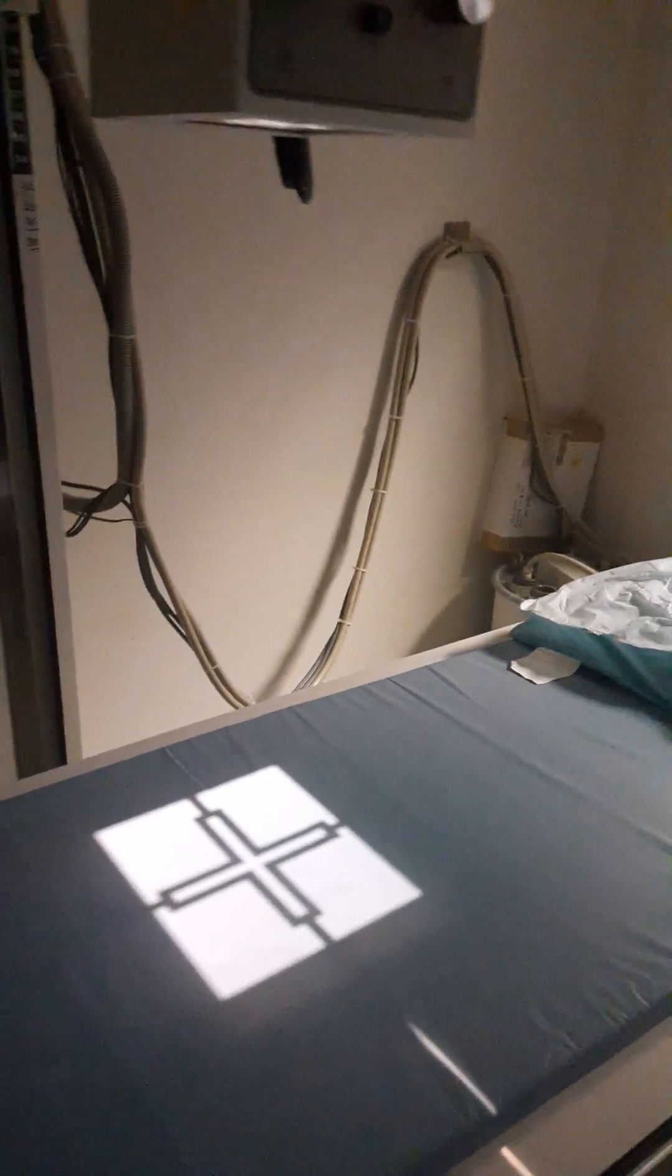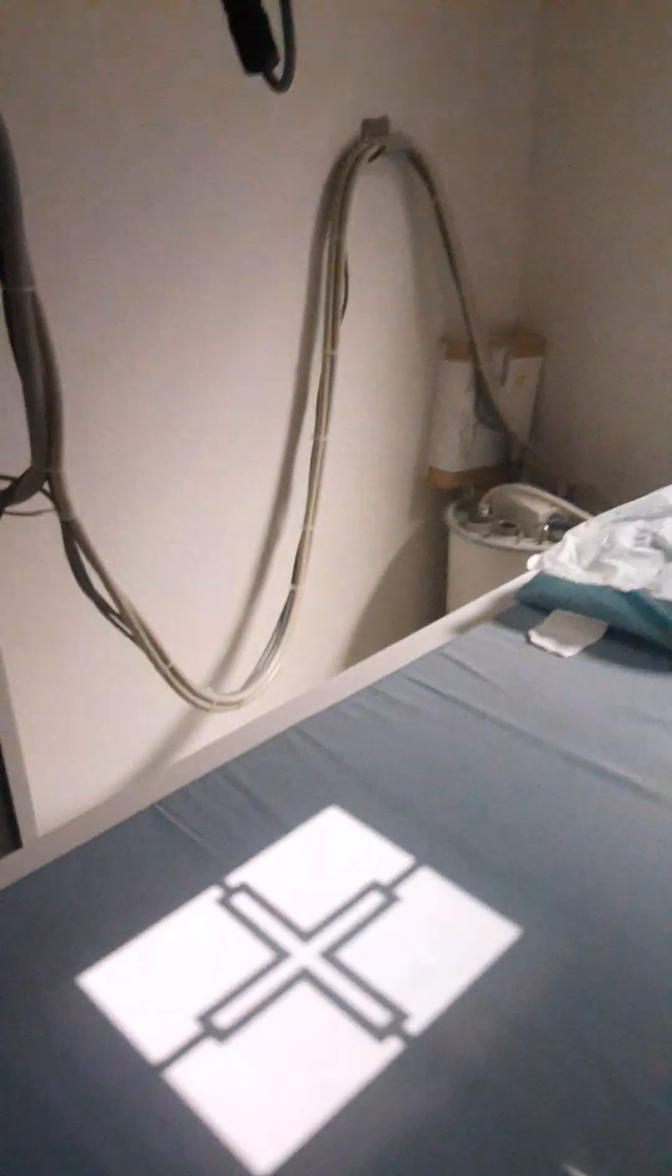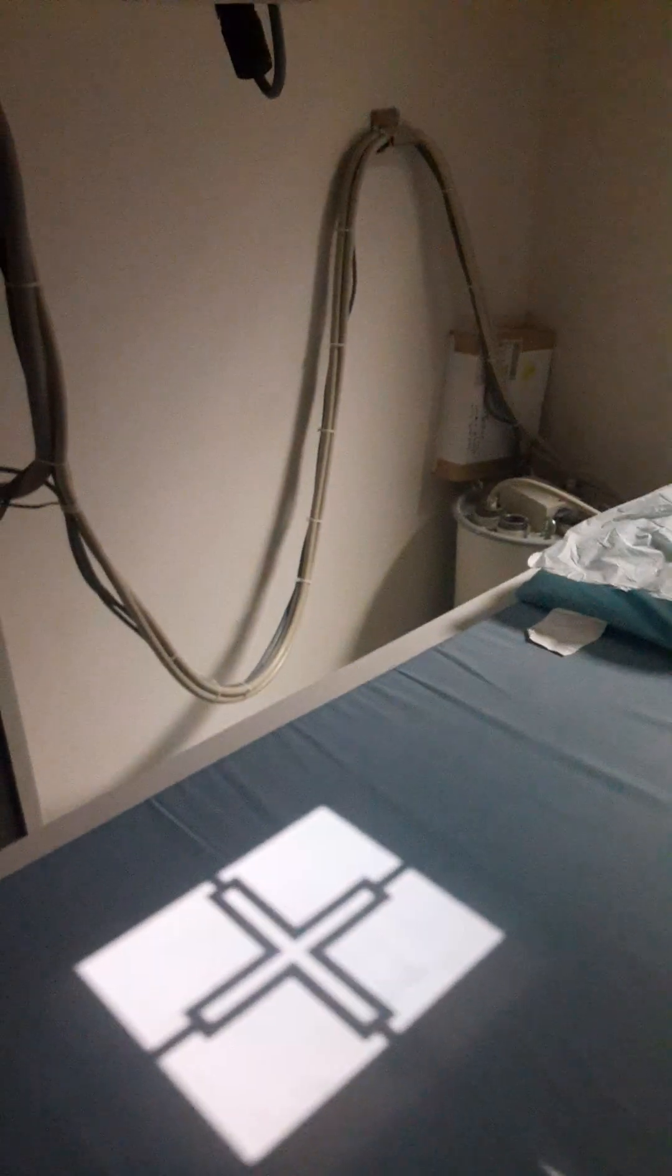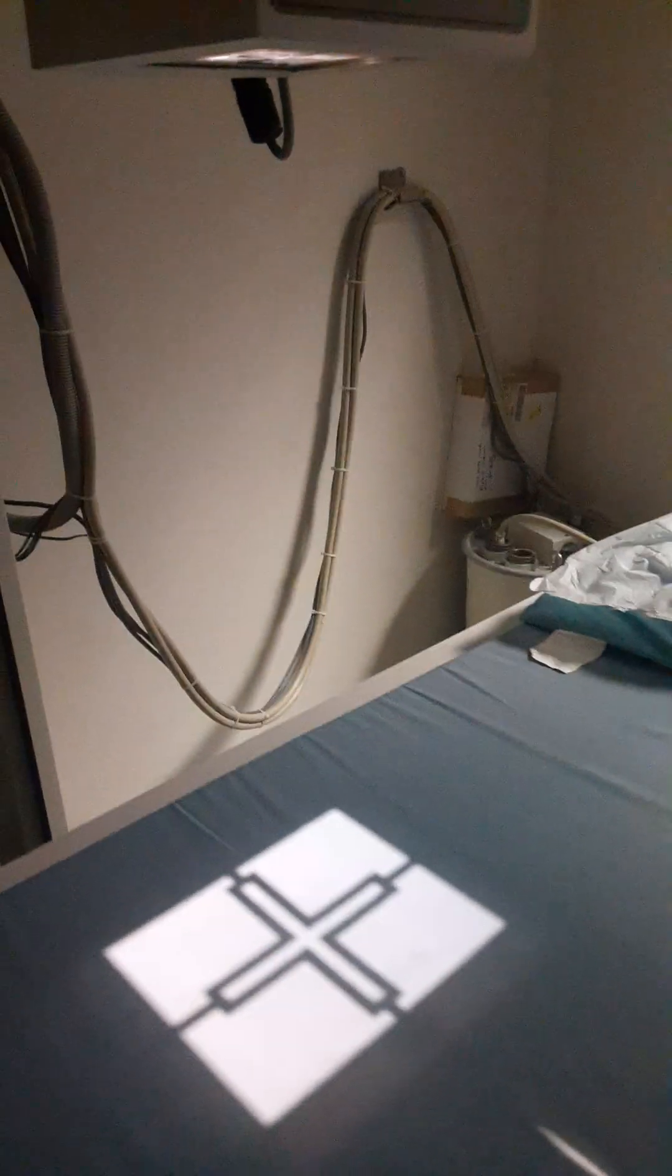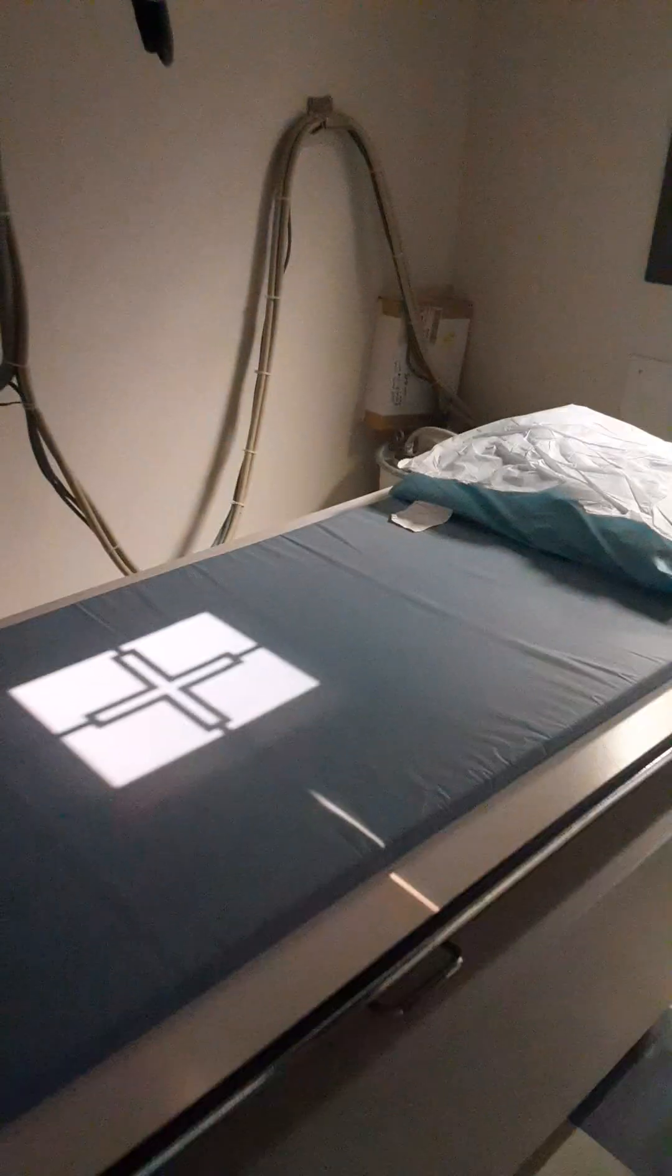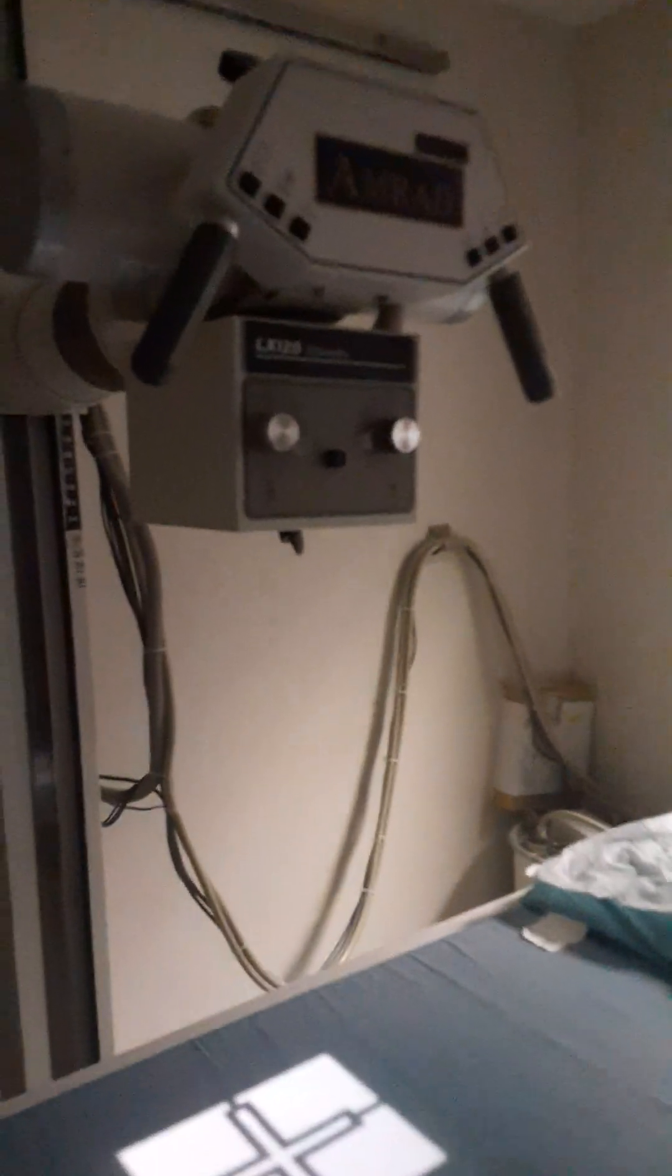So it still doesn't look quite right. That looks better. Now we have a 10 by 12 portrait with our numbers here matching up at the 40 inch line.